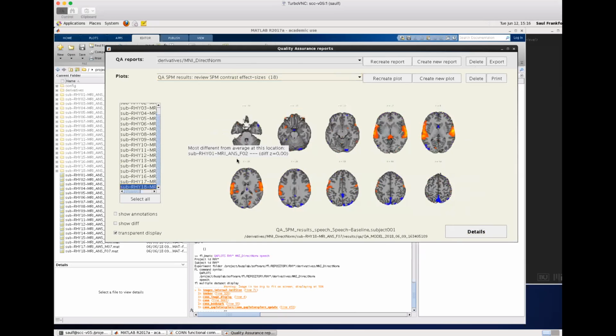I was originally doing it for an experiment which has a lot of motion, but in this case, it's probably not that needed because there's only a couple of subjects that show a lot of motion. But in any way, I'll let you know when that is available, so you can also give that a try. It's an alternative way of removing potential residual motion or physiological effects that are in the data even after all of the things that we are controlling for.